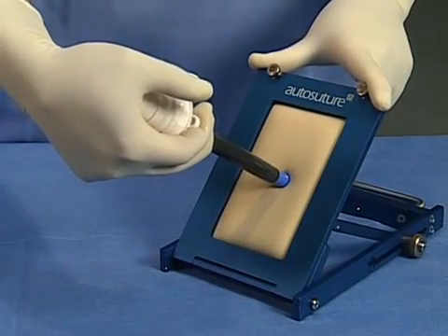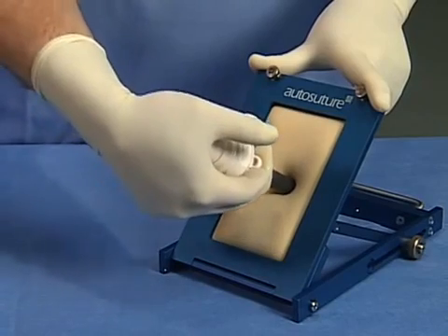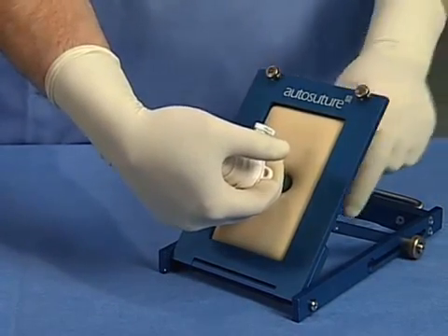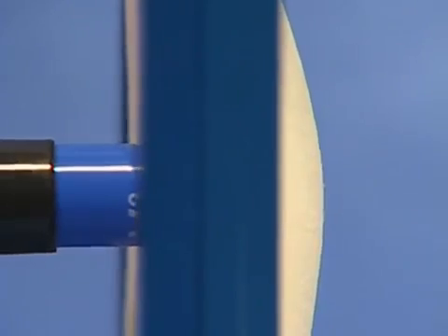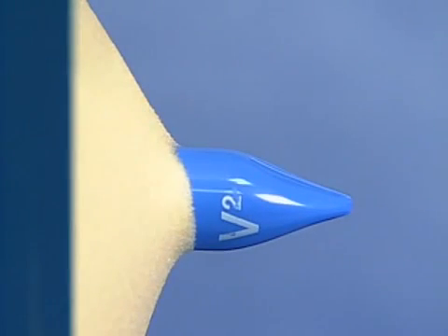During insertion, you will hear two distinct clicks. The first click tells you the shield has retracted. Upon entering the free space in the abdominal cavity, the shield covers the linear blade and locks into place, reducing the potential for injury to internal structures.